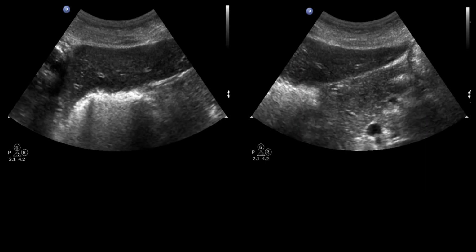A quick note about the long left lobe lateral picture. Depending on the anatomy of your patient, some people have very large left lobes, some people have very tiny left lobes. So if you have a patient that has a longer left lobe, what you'll want to do is first take an image which includes the diaphragm and the heart and the superior portion of that long left lobe lateral plane.